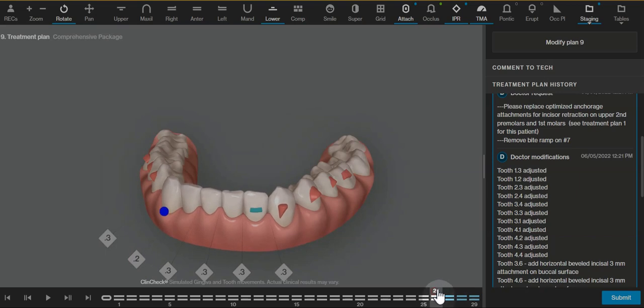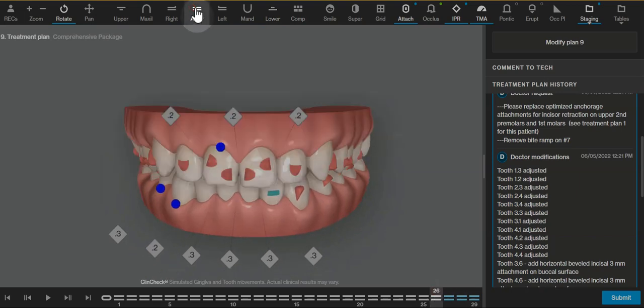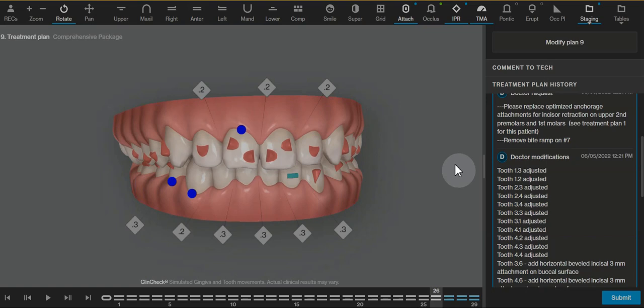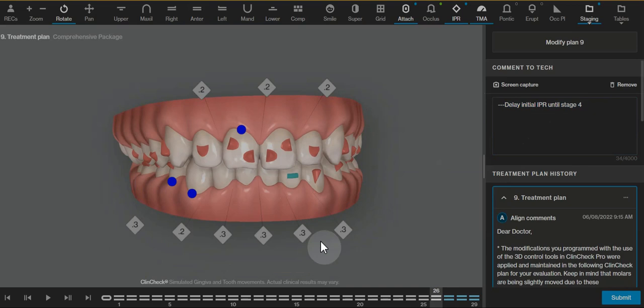C chain aligners are always here for when we're closing anterior spaces. Be sure to use those only one at a time, and if you wanted to delay the IPR per your request, you can submit this last request. I'm sorry I didn't have that initially, and then the next ClinCheck would be the one ready for you to approve. Let me know if you have any other questions.